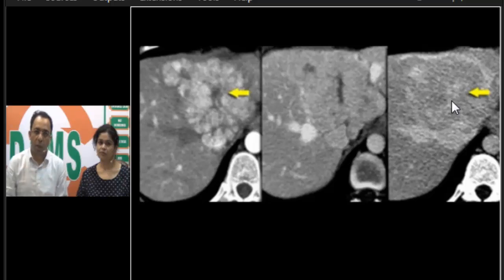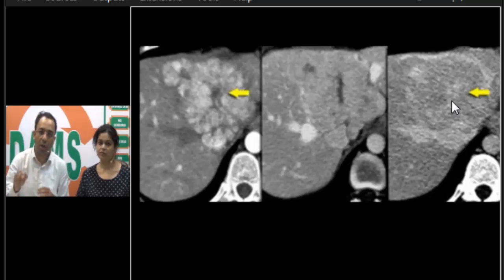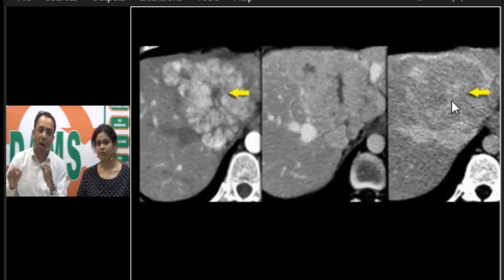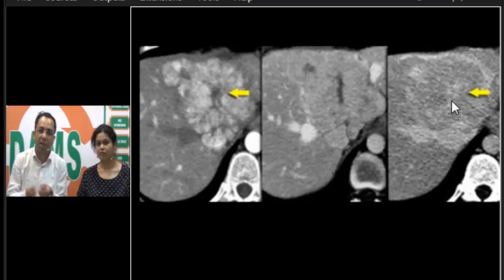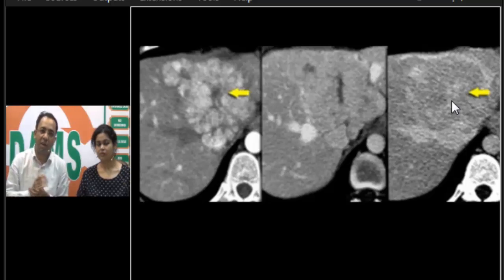We've done a previous video on liver hemangioma on the DAMS Daily channel. Liver hemangioma shows peripheral nodular enhancement in the arterial phase with delayed centripetal filling — this is how we know this lesion is not a hemangioma.